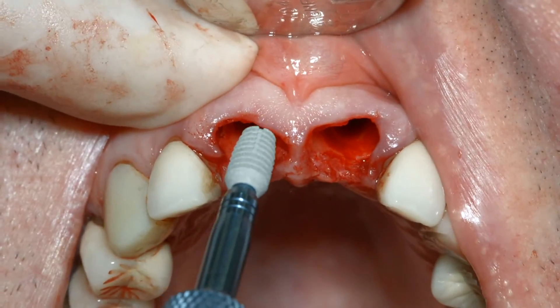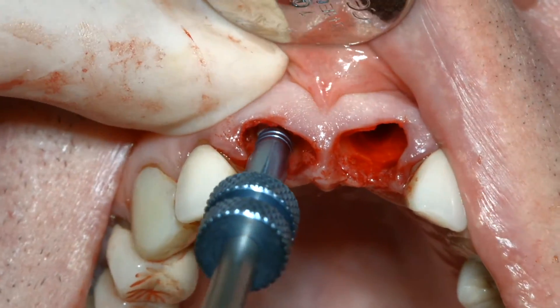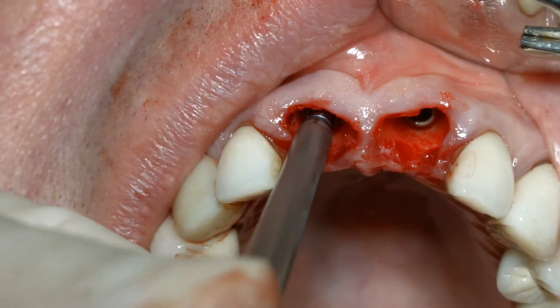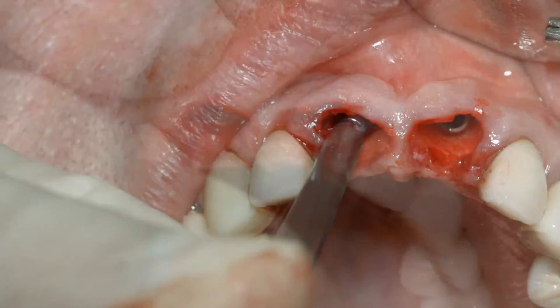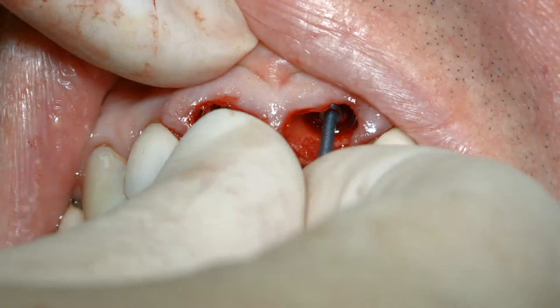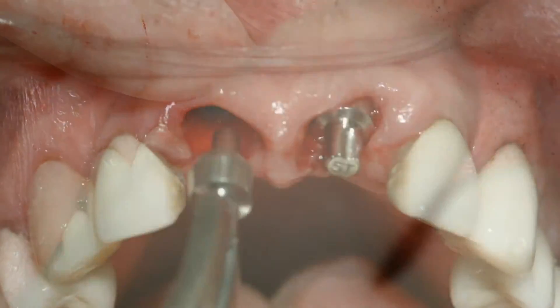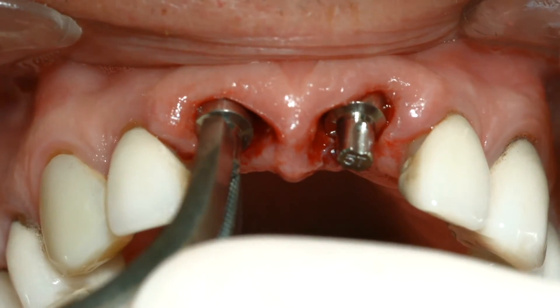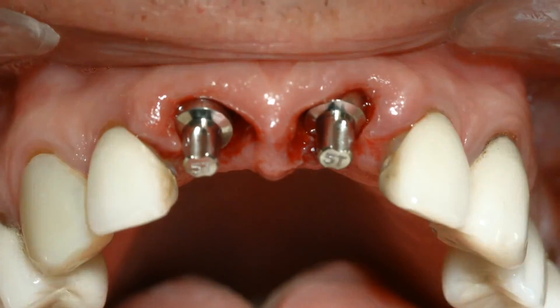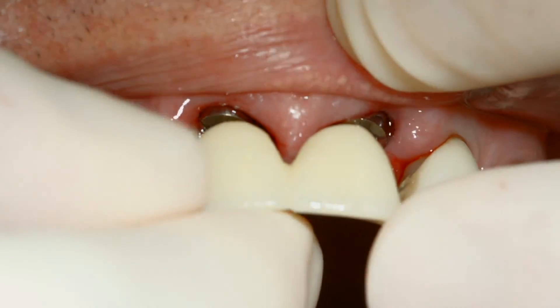The implants were inserted with an implant inserter-retriever instrument and definitively seated with a seating tip attached to a straight driver. Blue 2.5 mm guide pins were inserted into the wells of the implants to confirm their trajectories. Then two 5-tall profile universal abutments were inserted into the wells of the implants prior to confirming the adaptation of the TRINIA stabilizing prosthesis.